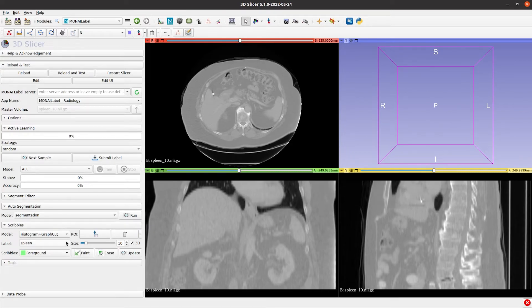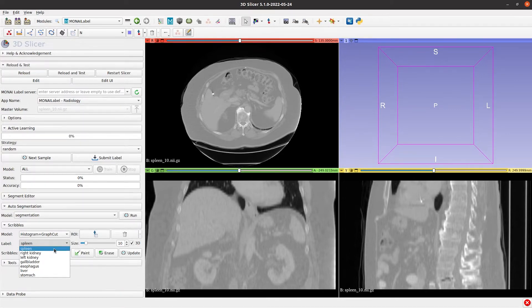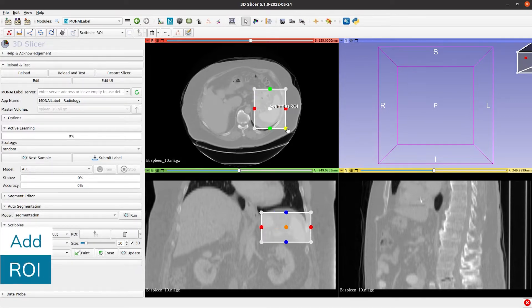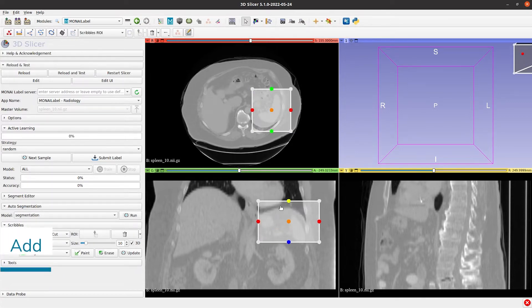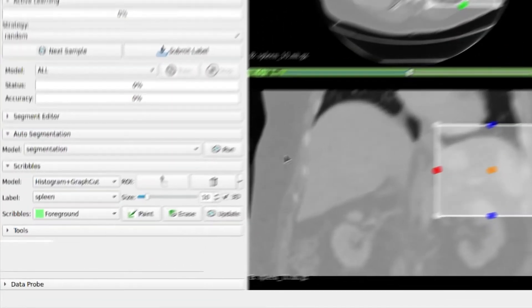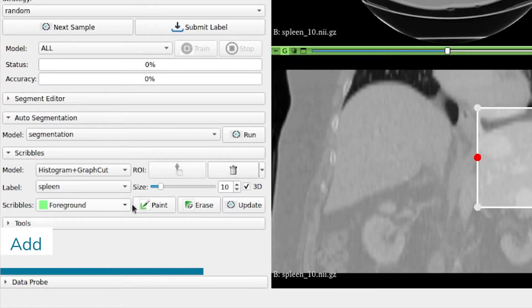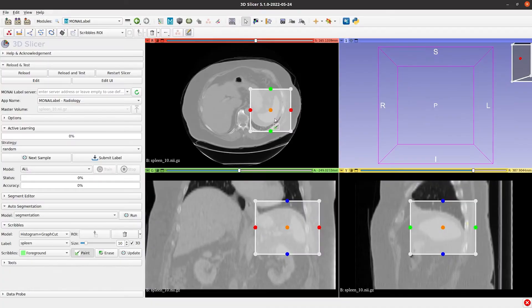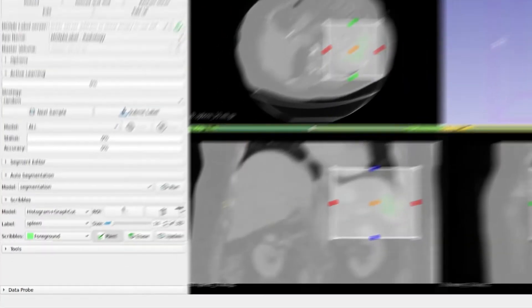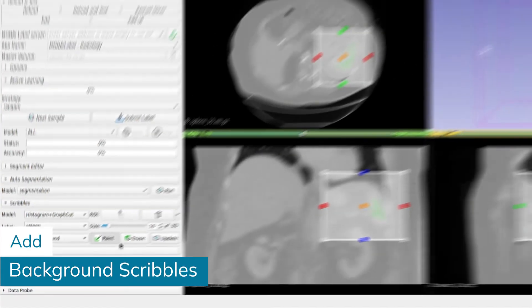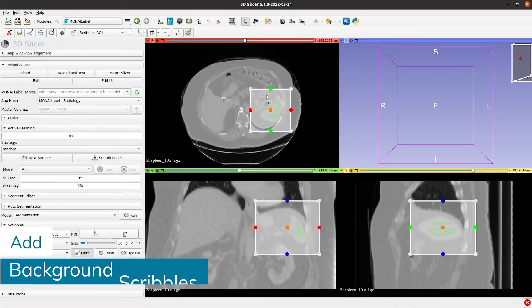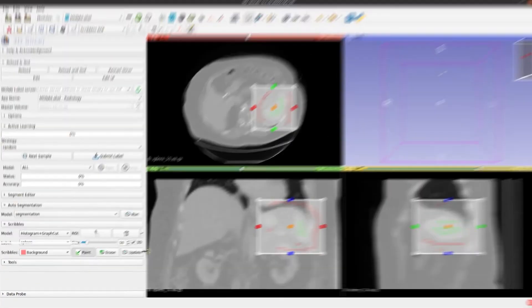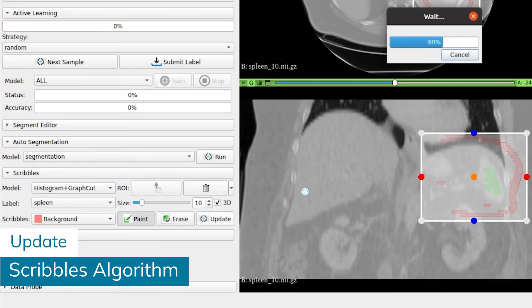Then we go to Scribbles tab and start creating the labels we define in the config file. I start with the Spleen Organ. For this, we add an ROI covering the Organ in all views. Then we add the foreground Scribbles and the background Scribbles. Once we add the Scribbles, we click on Update button to get the segmentation.